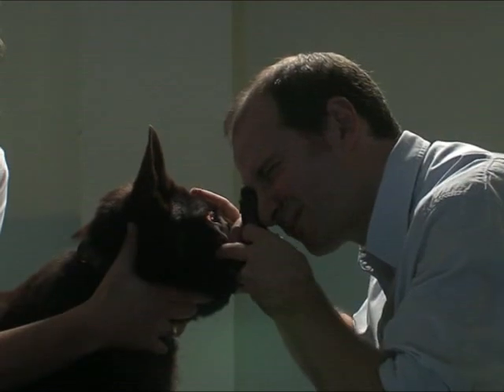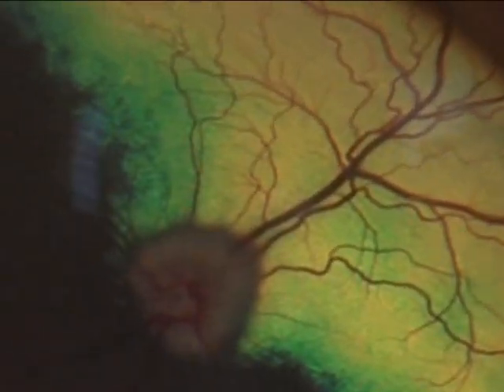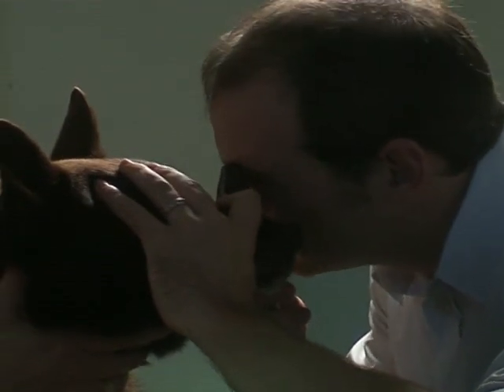The direct ophthalmoscope offers you a direct view. You are looking at the fundus itself when you use the direct ophthalmoscope. It gives you a very high magnification of the structures you view, but therefore you need to work quite hard to examine the whole of the fundus.